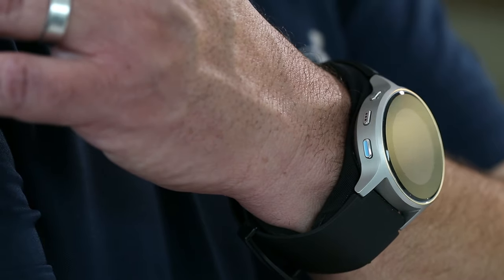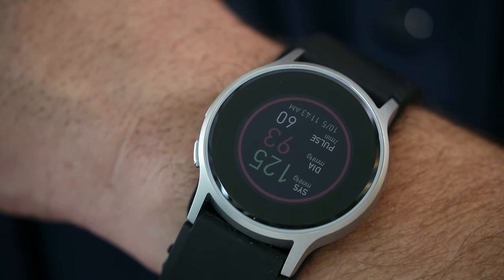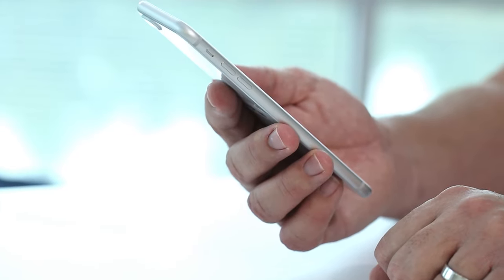Once the measurement is complete, the watch will emit a light vibration. Results can then be transferred to the Omron app for further review.